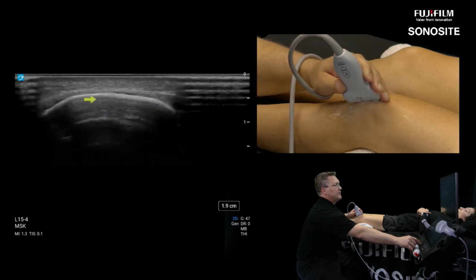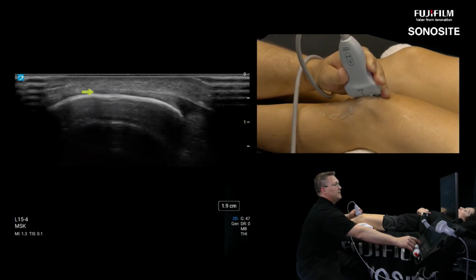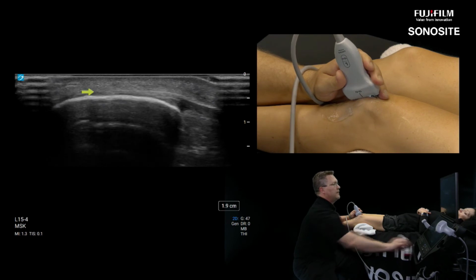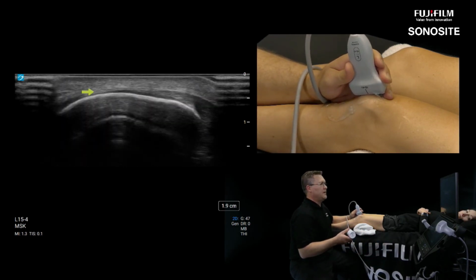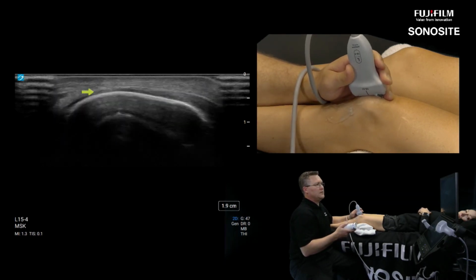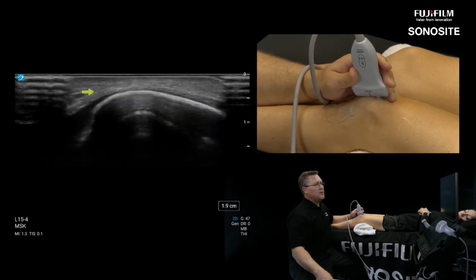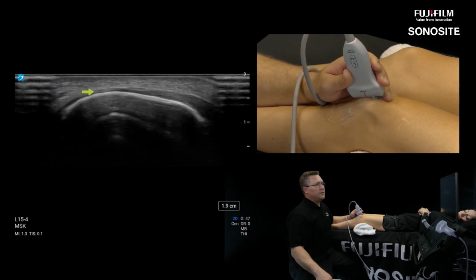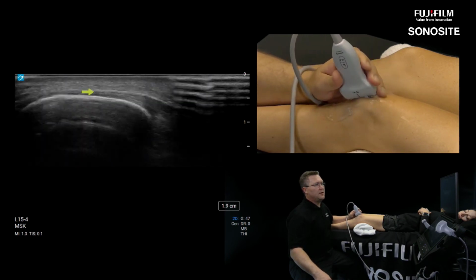Medially and laterally, you'll see some similarities of the aponeurosis too. But right there is definitely a thickening of the contiguous fascia that envelops the kneecap and blends with the rectus femoris layer. So you can actually see that communication, and injuries can happen up here. So if it's very tender, don't rule out some sort of quad pathology, okay, or infrapatellar pathology if it hurts either way.